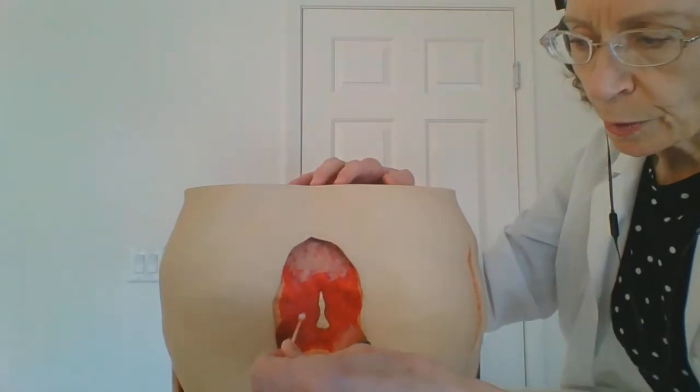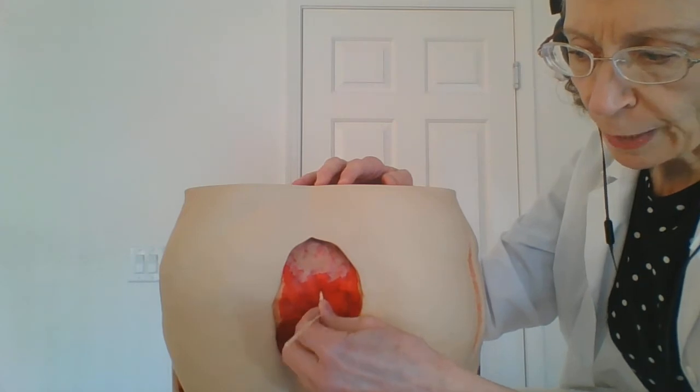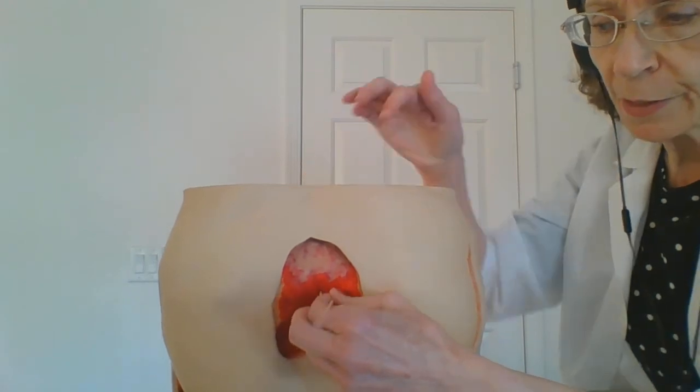Next, I'm going to take a Q-tip, and I'm going to open it up because I need to measure the depth of the wound. Okay. So, of course, I'd have gloves on. I don't have any gloves with me, but you'd have gloves on. So to measure the depth of this wound, I'm going to probe it, and wherever I find what I consider the deepest part, I'm going to let my hand rest on the edge and hold it up like that.